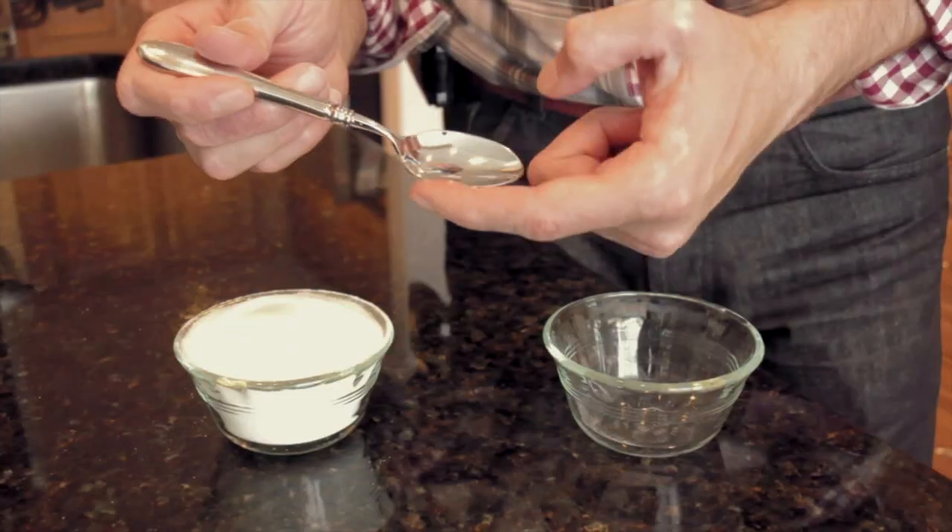In order to understand that, we need to think of our endodontic files like spoons. A spoon has a concave area, which would be akin to the chip space in your endodontic rotary file, and then it has these little borders and perimeters, which we're going to think of as the blades of your endodontic file.